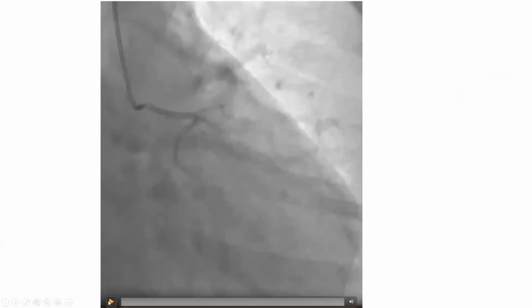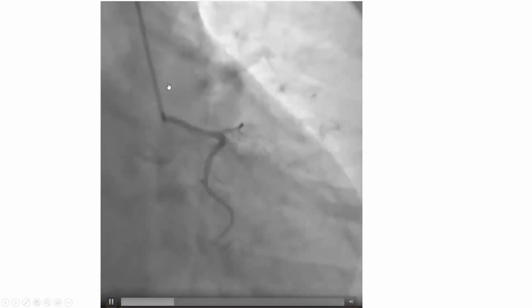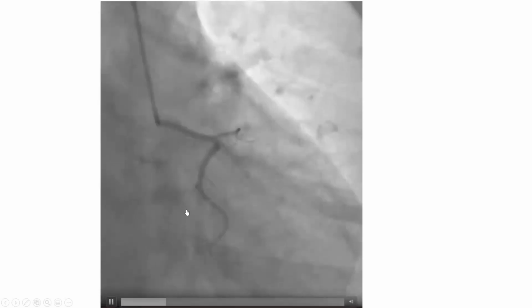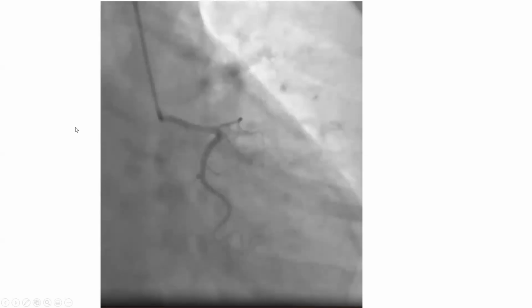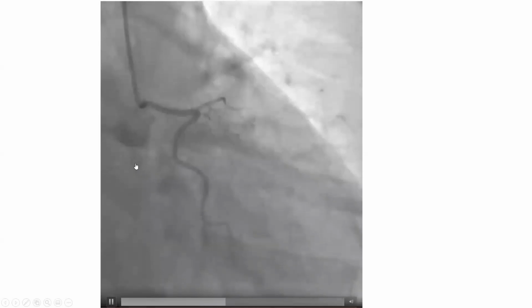And in this particular patient, the left circumflex is coming off the left coronary sinus, so as normal. So when we engage the left coronary, we could see what looks like a left main and left circumflex. This is just an isolated left circumflex, kind of like what I showed earlier, an isolated LAD with an anomalous left circumflex. Except this anomaly here, where an LAD arises from a right sinus, is rare, much more rare than an anomalous left circ from a right sinus.